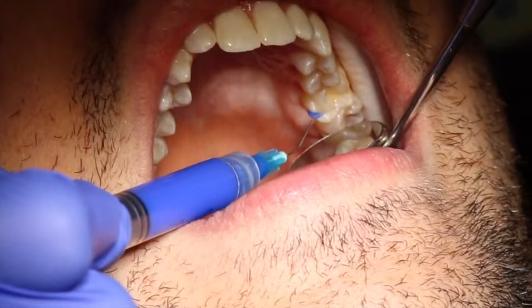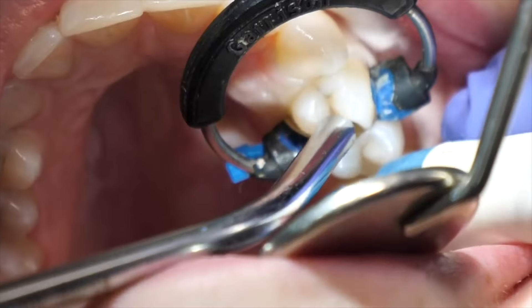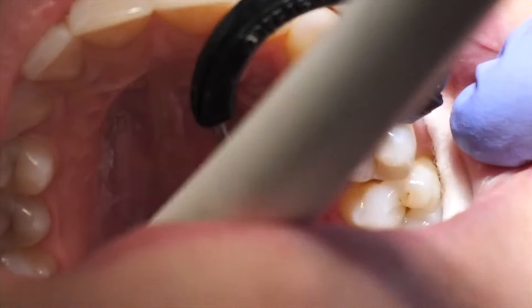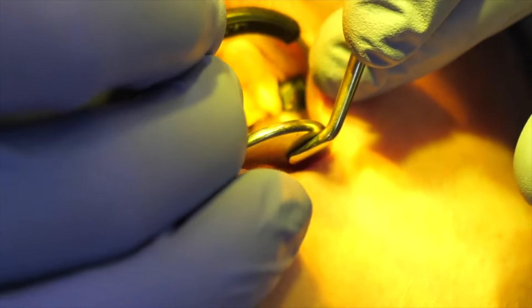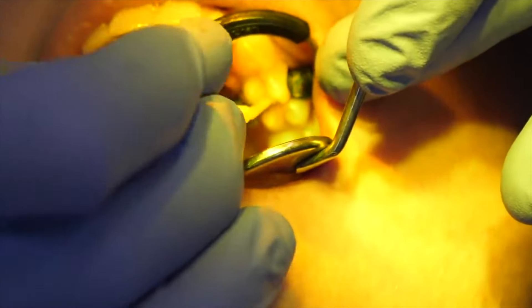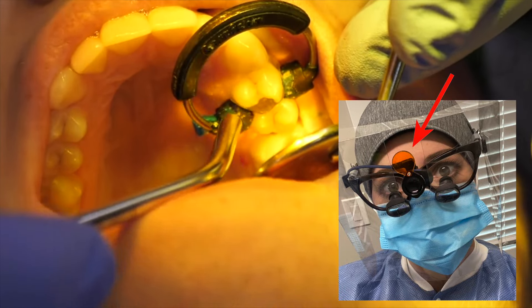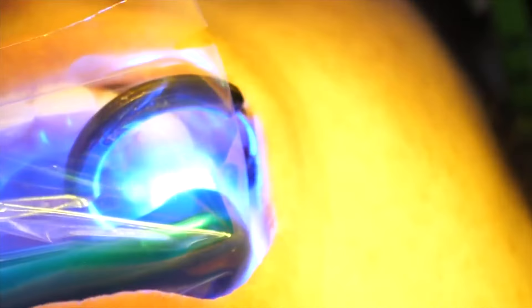The etch is used to roughen the surface of the enamel. They will then rinse it off, dry it, and then apply the bonding agent, then the adhesive, which is light cured. If you see them putting up their little orange part of their glasses, their loupes, it's because they've moved on to the light curing part.